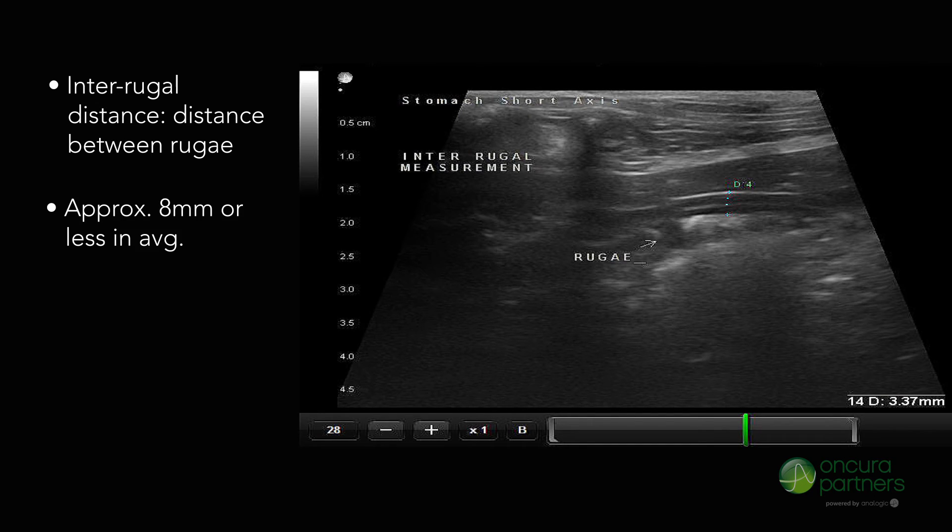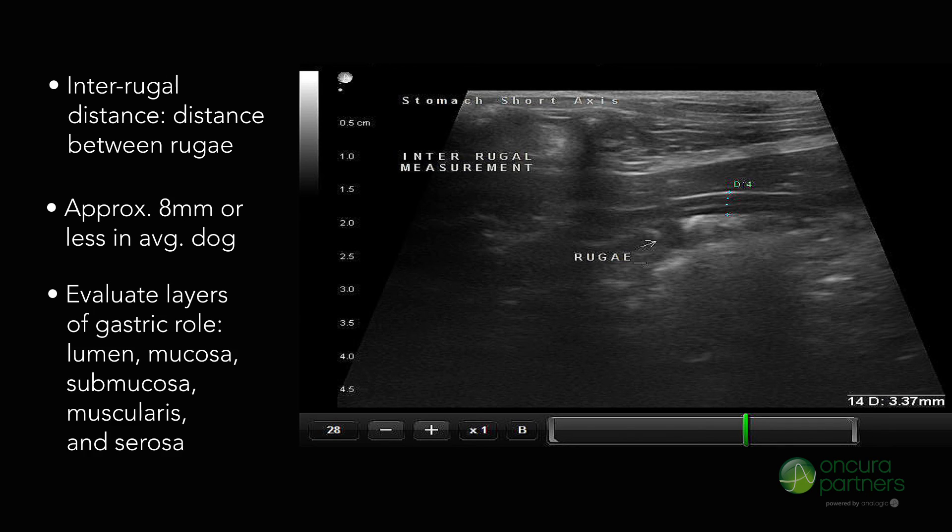This measurement should be about eight millimeters or less in an average dog. When using high-frequency transducers, evaluate the layers of the gastric wall, which includes the lumen, mucosa, submucosa, muscularis, and serosa.